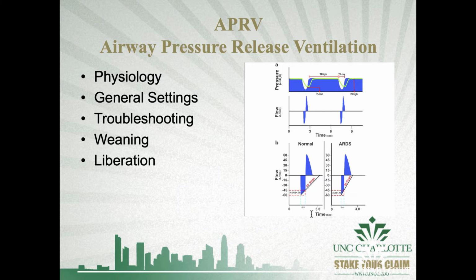And this is something that we often come into problems with APRV. You'll have a sedated and paralyzed patient in APRV. I don't really see the benefit in that. We can have them on conventional mechanical ventilation that's proven, and not worry about an increased elastance of the lung due to a paralytic, for example.